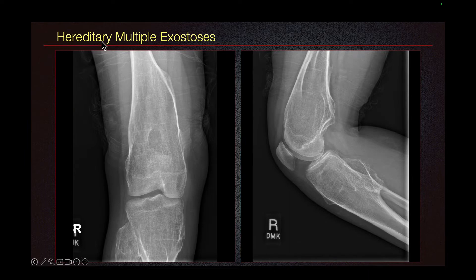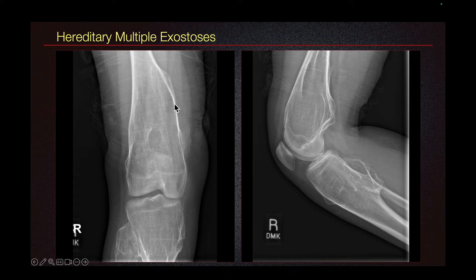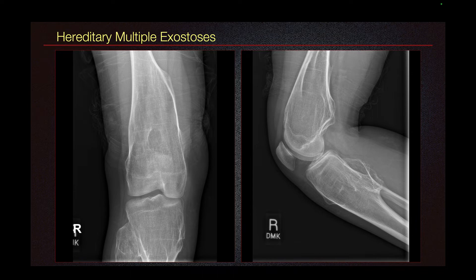Here we have a case of hereditary multiple exostosis where the patient has multiple osteochondromas — for example, in the distal femur, fibular head, posterior tibia, and anterior tibia. We can see that the cortex and medullary cavity of the underlying bone is continuous with the osteochondroma. A diagnosis of osteochondroma does not need MRI, but if there is concern about cartilage cap, malignant transformation, or pain in the area related to adventitial bursal formation, then an MRI could be obtained.